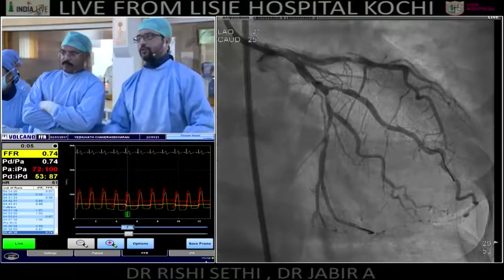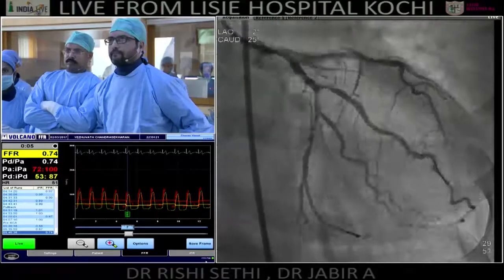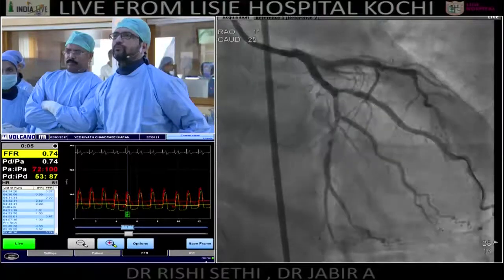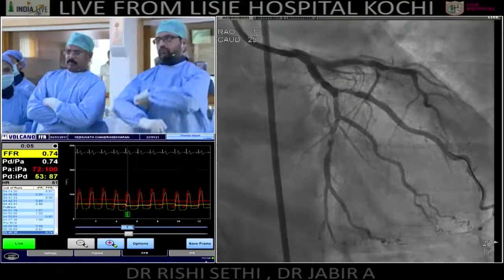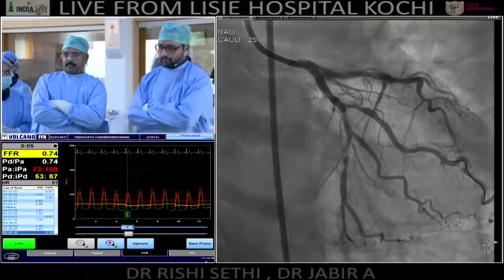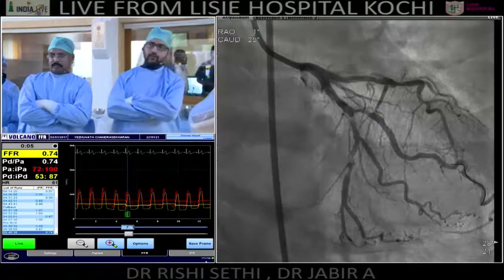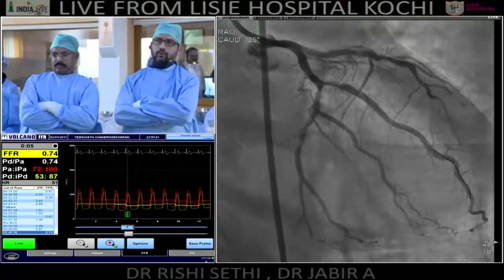Is it the spasm close to the OM? If you do the retrospective study that shows that type of lesion, in the next 5 years, the chance of MI is more than 70% of cases. Rishi, this is Dr. Anand Rao. Is there a landing zone below the OM? Can you see in a different view whether you can just stent it?